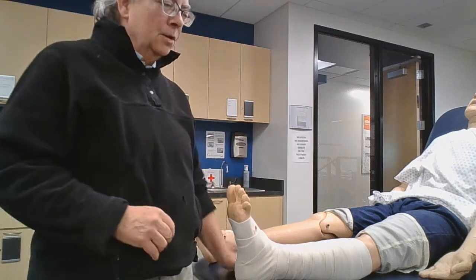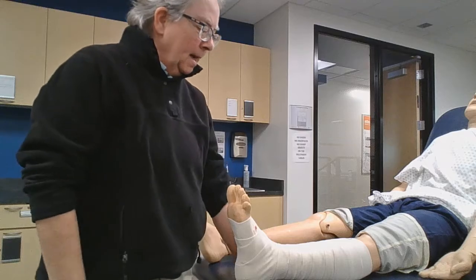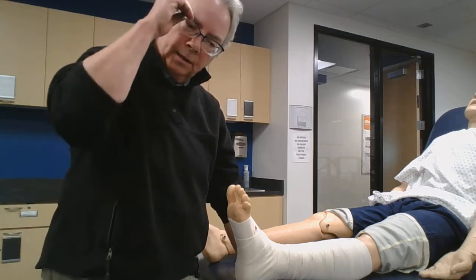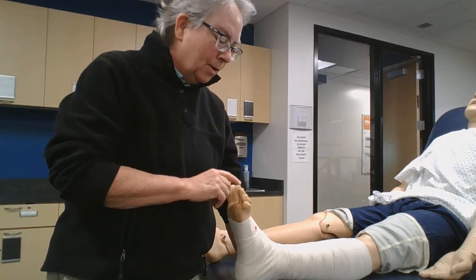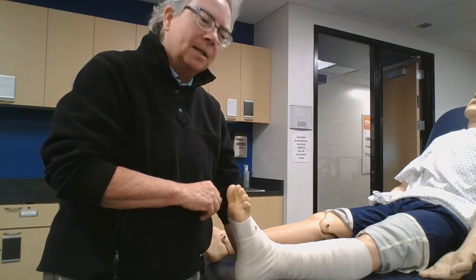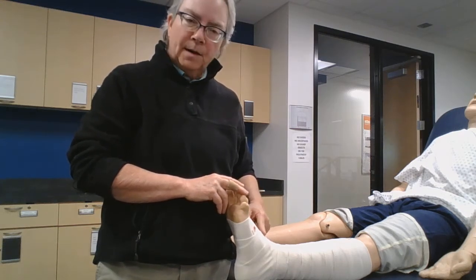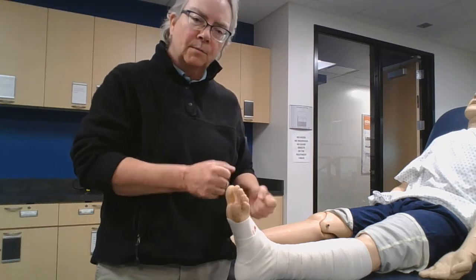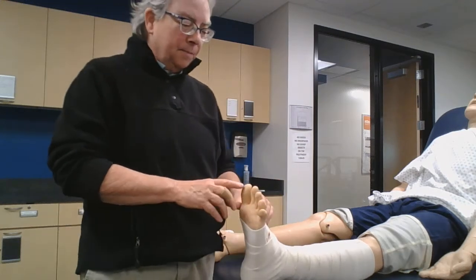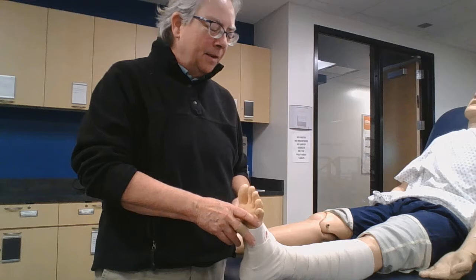And actually, every year there's students that wrap, and they're doing a great job, and they're doing good compression. And then as they're educating the patient, I'll say, hey, did you check the toes before the patient left? And they'll look down, and every year there's some patient, one of you guys, they have purple toes. And that means that probably they got too much compression here at the dorsalis pedis, okay? It's generally that one there where you got a little too heavy with the compression down there, pulling it tight. And then I bring all the students in to show that because it's real. You have to make sure that your patients aren't leaving and you're restricting their blood flow from compression, okay? And they're all like, wow, it really does happen.